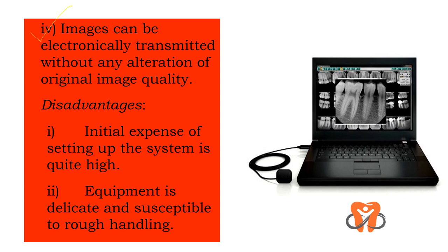And disadvantages: the initial expense of setting up the system is quite high, and the equipment is delicate and susceptible to rough handling.